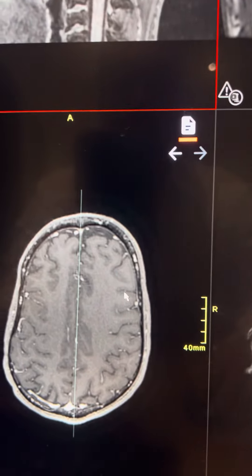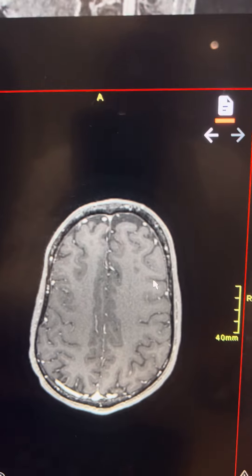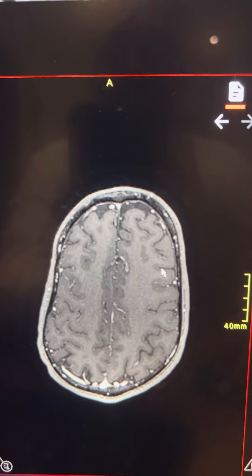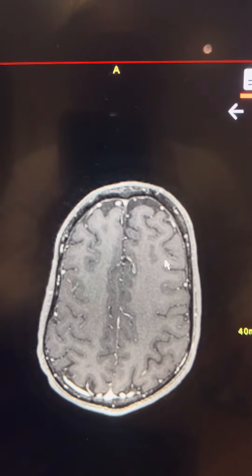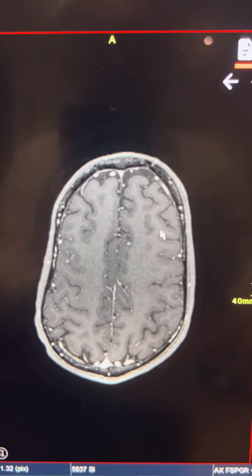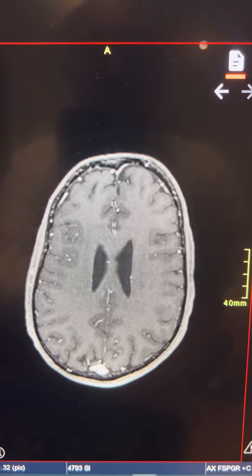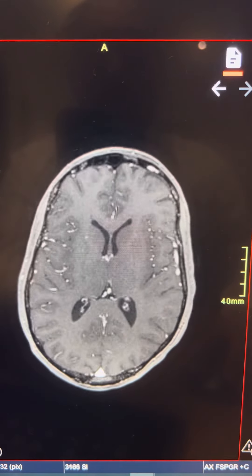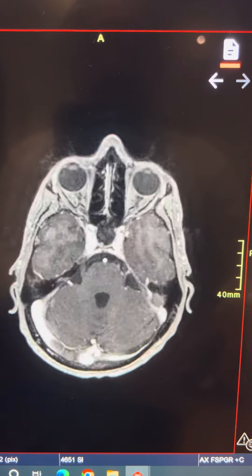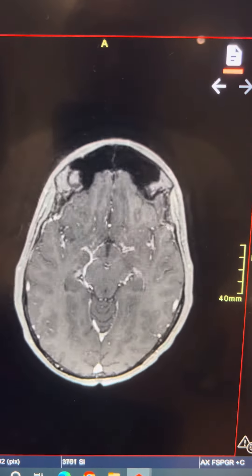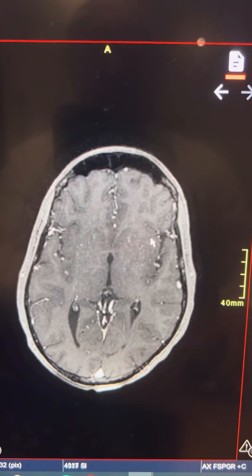Sometimes patients will present with chemical meningitis secondary to the rupture of the dermoid cyst, and you will be looking for any signs of enhancement or meningitis, which this patient does not have.